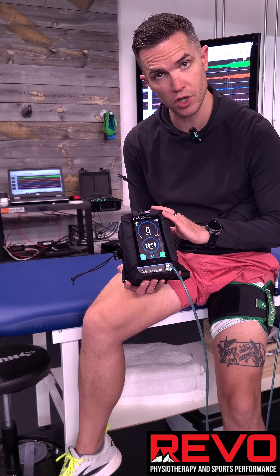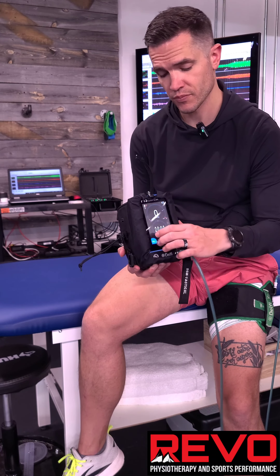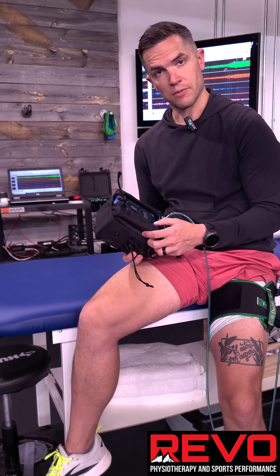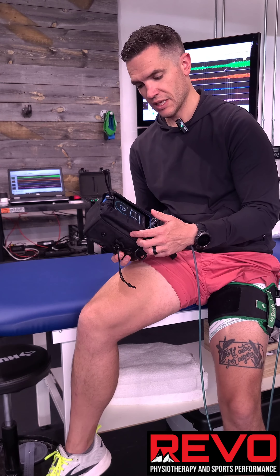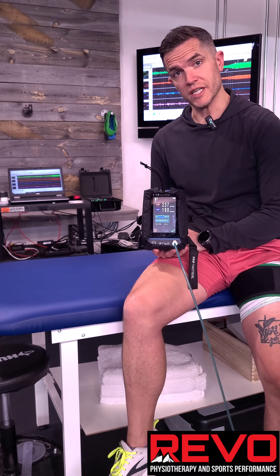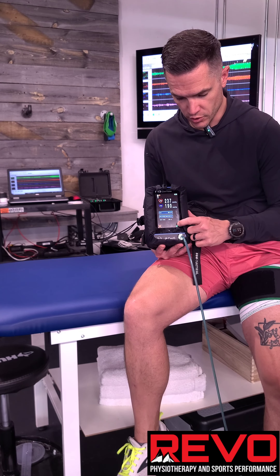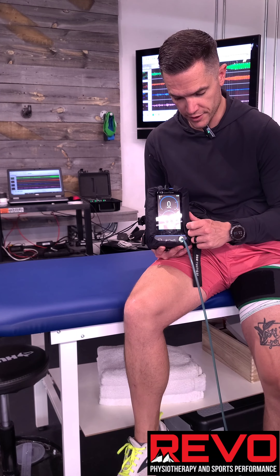Now that we've confirmed the protocol is correct, you're going to lie completely flat and press this blue PTP button in the lower left-hand corner. Lie flat and let it do its thing — it's gonna take some time to calibrate. Once it does calibrate, it's going to deflate the cuff and you're left with the measurement of 80% of your total limb occlusion pressure. Now you're still lying down, the machine is calibrated. Press that green check mark and then press the inflate button. It's going to inflate to that 80% and you're off to the races.